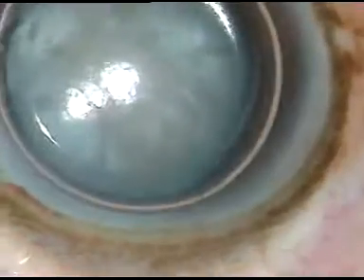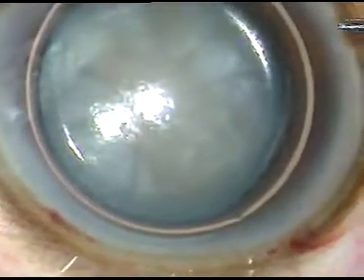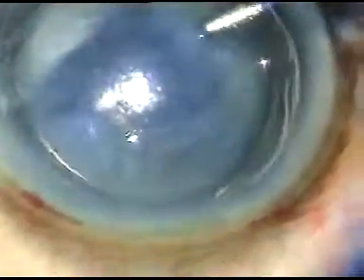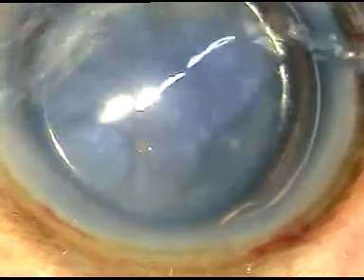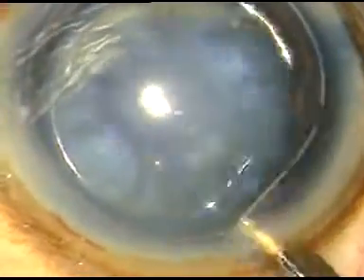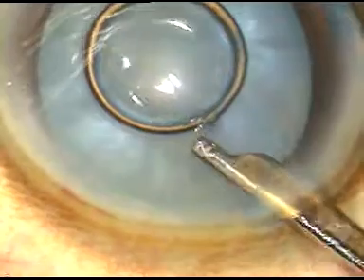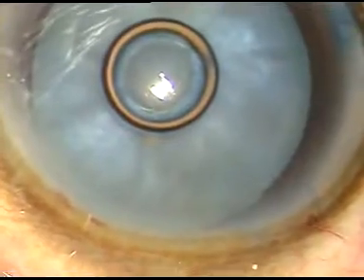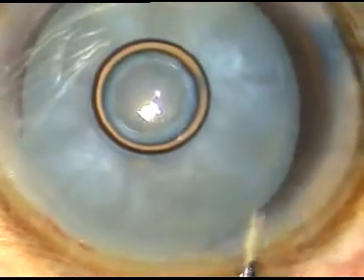This is the first case. The capsule is being stained with trypan blue dye. After making all the incisions and injecting an air bubble in the anterior chamber, the dye is washed out. This is trypan blue 0.06% dye. Now HPMC is injected into the anterior chamber.